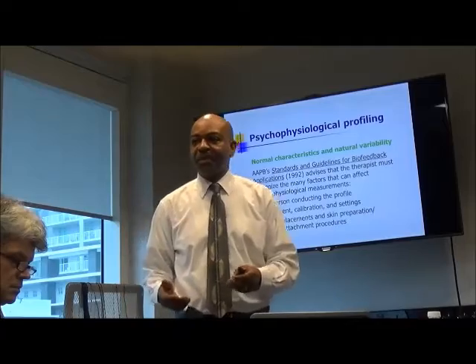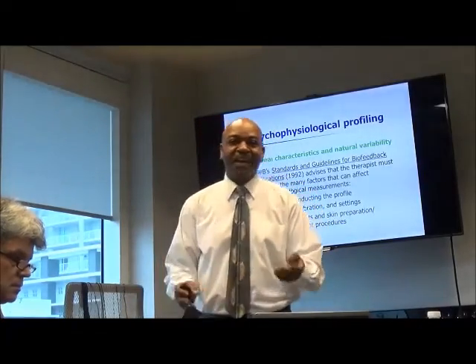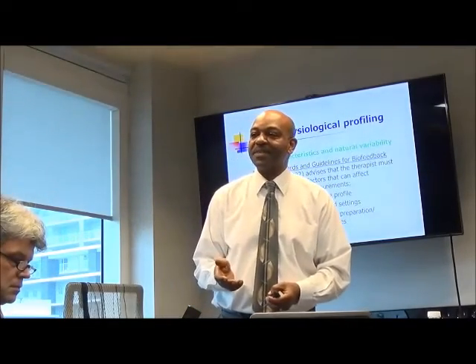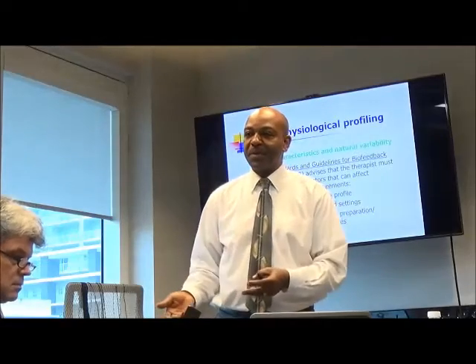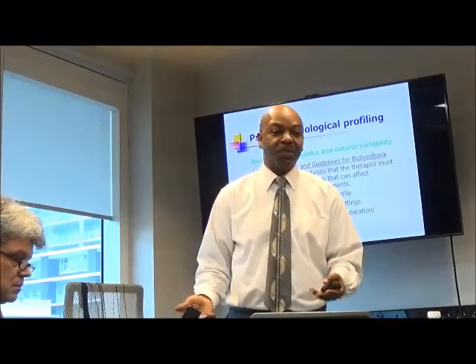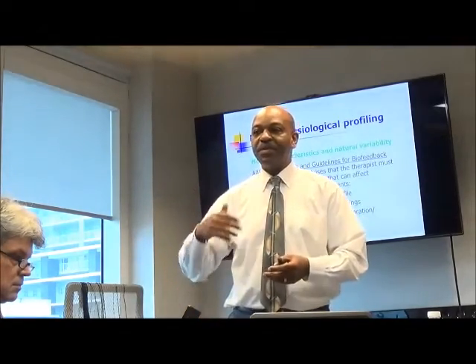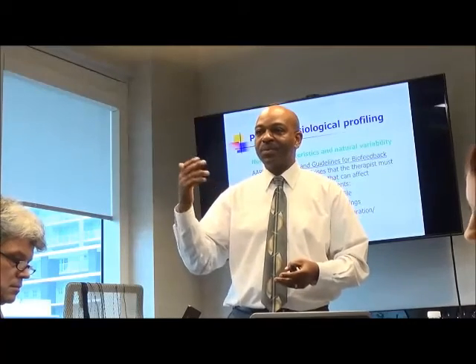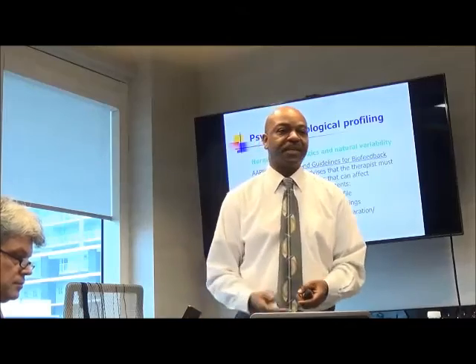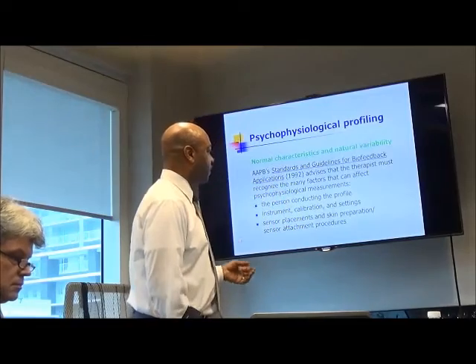If you have someone that's really mean that's doing it, or somebody that's very kind, you need to be careful sometimes when you're doing a stress assessment that you don't start doing therapy already, because the person may start to relax more than they normally would just because of how you're talking to them, and you may start, without even intending to, talking about their breathing and their muscles and relaxing and things like that. So you want to avoid those kinds of things because it can affect the results.